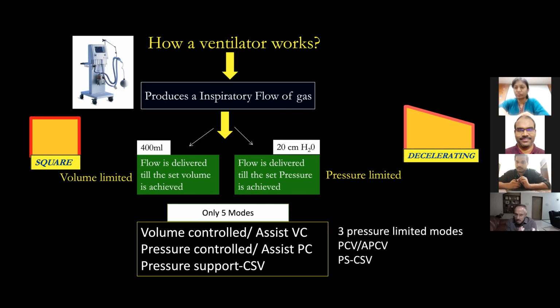So you tend to keep volume limited ventilation only in patients who are passive. When somebody starts breathing, it's not comfortable. Always you tend to change it to pressure limited ventilation. Understood, Nisha? Any doubt?